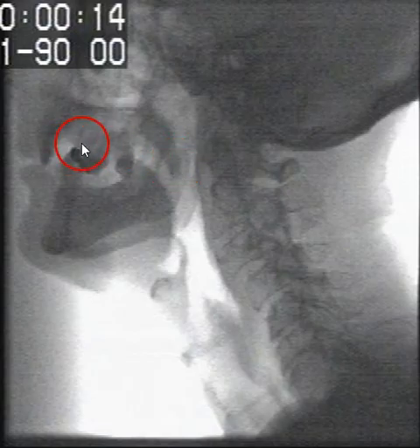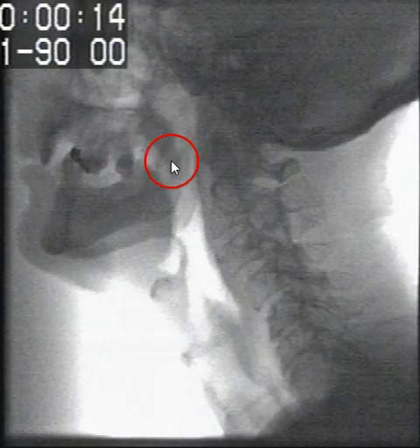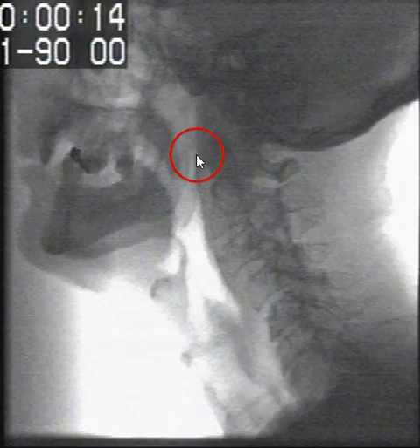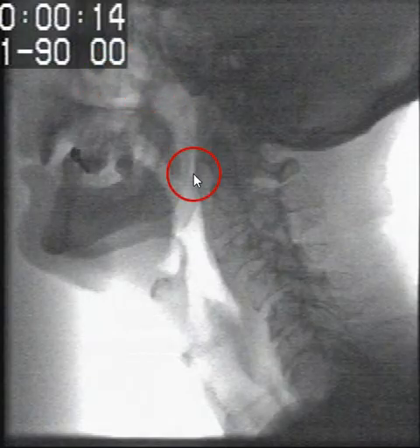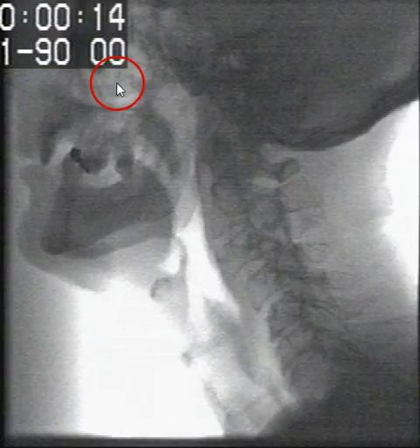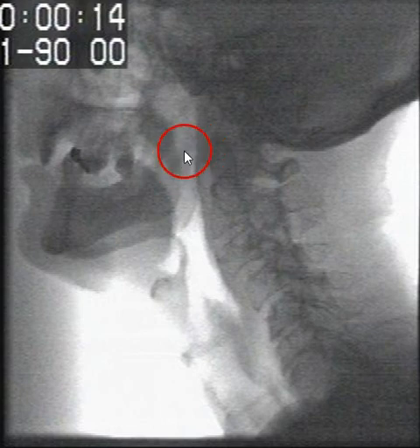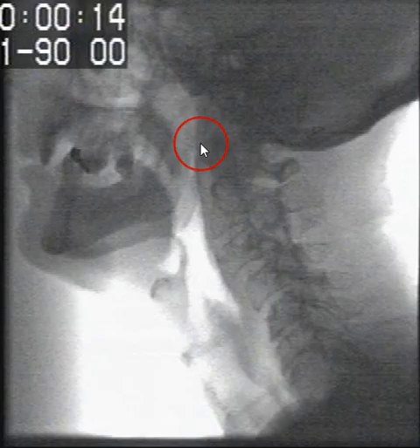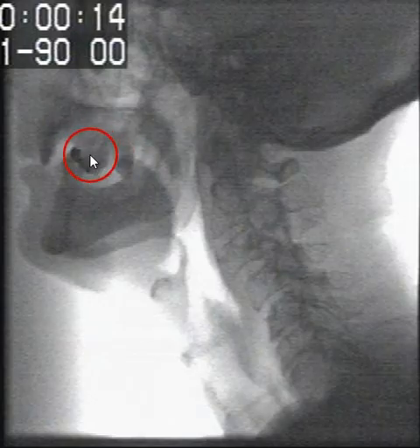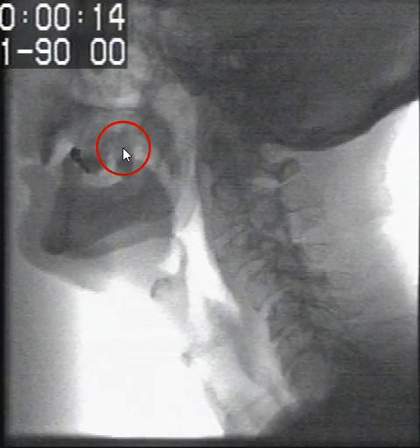During swallowing, as the bolus is moving back towards the tongue base, the soft palate or velum needs to move backwards and make contact with the posterior pharyngeal wall. This protects the nasopharynx or nasal cavity from any material being penetrated into this area. The area on the posterior pharyngeal wall where the soft palate moves back to is called Passavant's pad or Passavant's cushion.